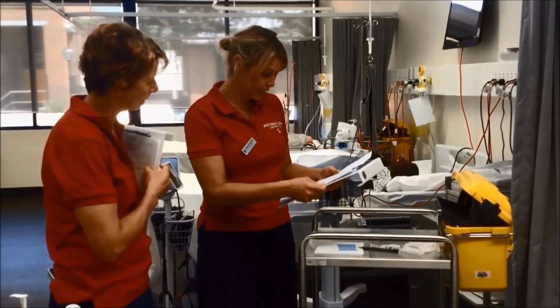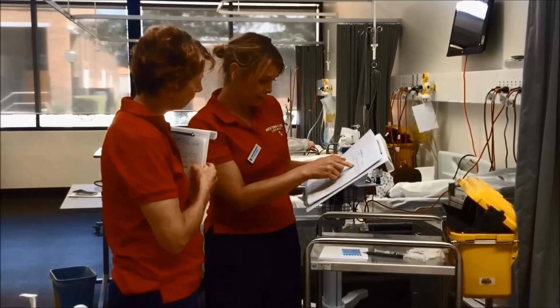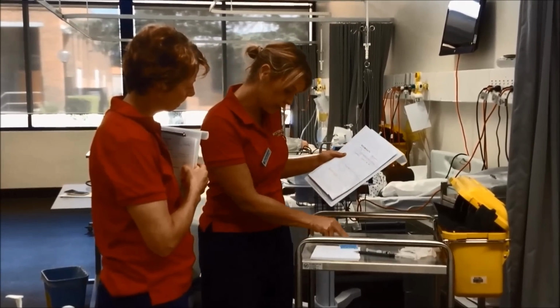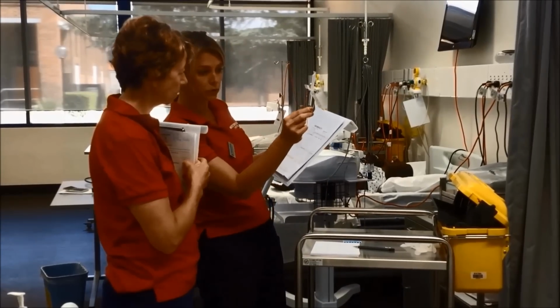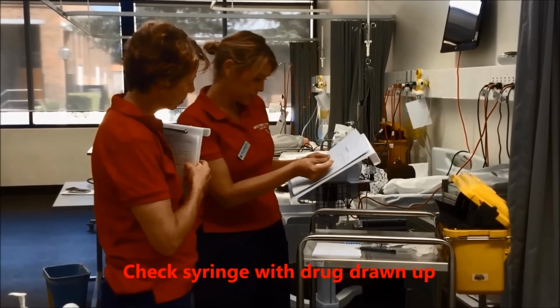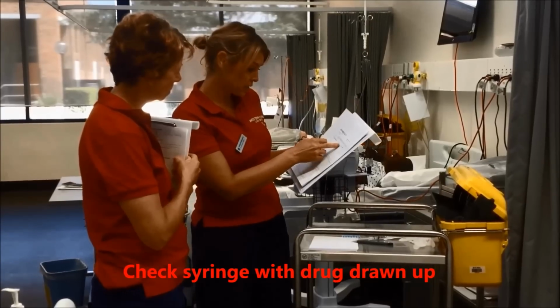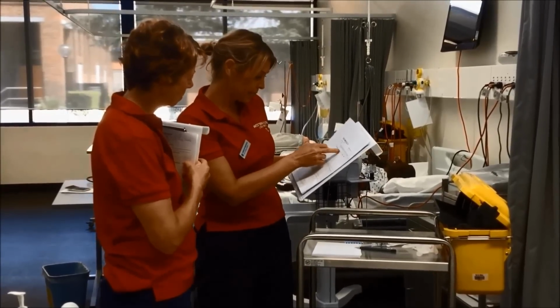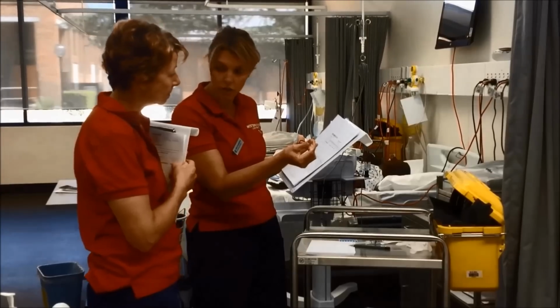I'll do them singly. I have Gentamicin, 80 milligrams, which I worked out was going to be 2 mils. I'll just get you to check that for me. 2 mils. Yep. It's IVI, which I'm going to put into the 100 ml bag. It's signed and dated by the doctor. Hasn't been given. It's IV and the expiry date's 2019.